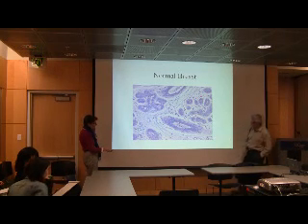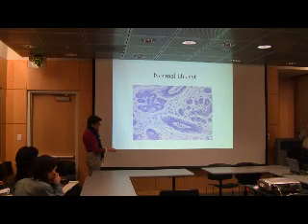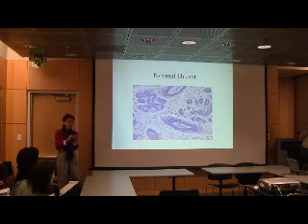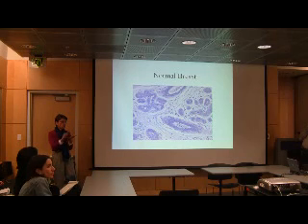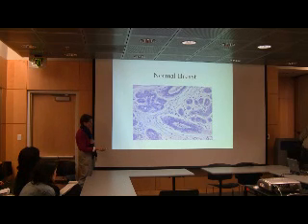And down here you can actually see a couple of small vessels. A little vessel, and they each have a little bit of blood in them. When you cut the tissue, the blood vessels drain out because they're open tubes. So often you don't see a whole lot; in life, this will be totally packed with red cells.